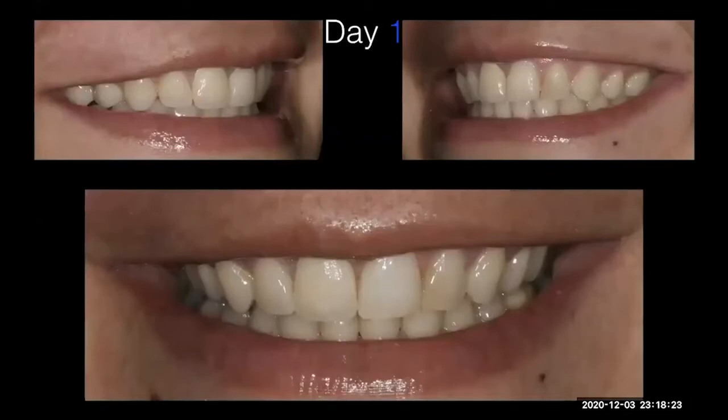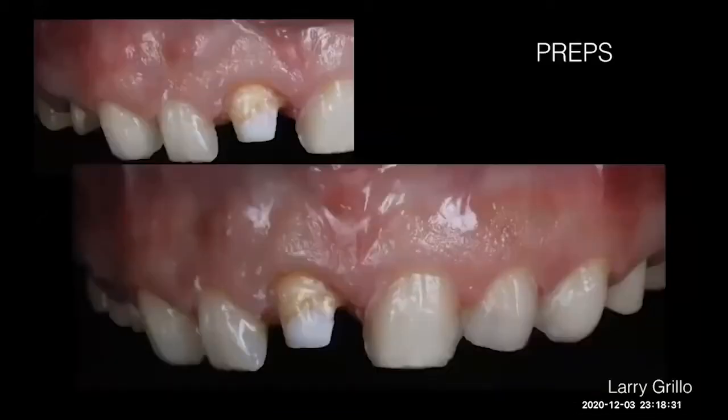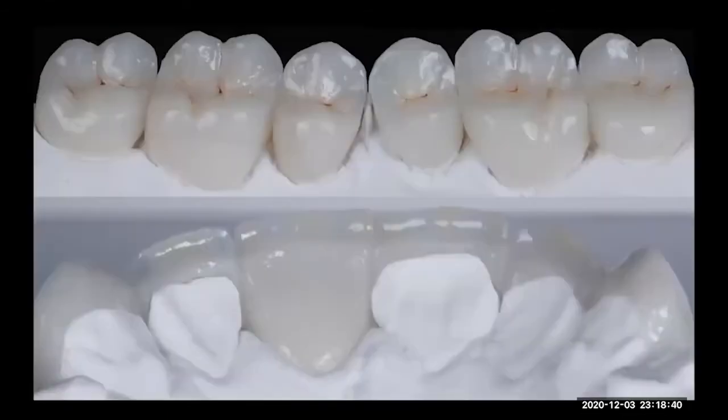This is another case that we are doing with some different crowns, different veneers with different stump shade colors. So this is our patient with the preparation. So in that case, for example, normally we wax everything. We use the geo wax a lot. We wax 100% everything in wax and then press.